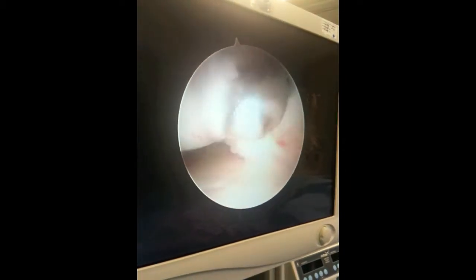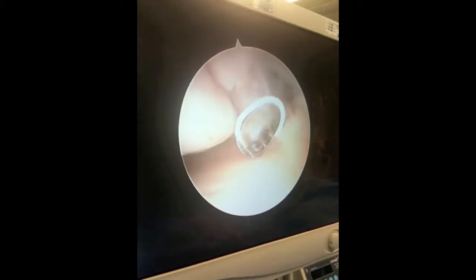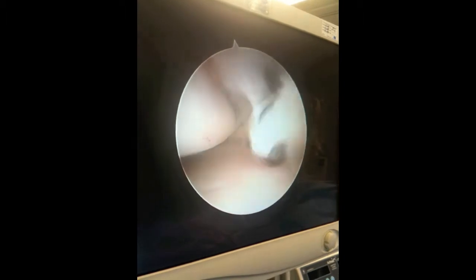You can see all these things in the way of the ankle joint, and the device is made to clean everything up. You can see it pulling right into the jaws and cleaning up the actual soft tissue that's pinching in the ankle joint.